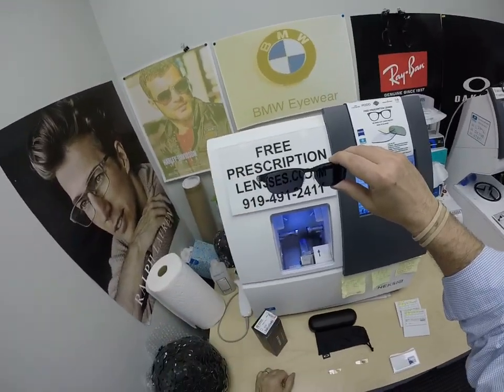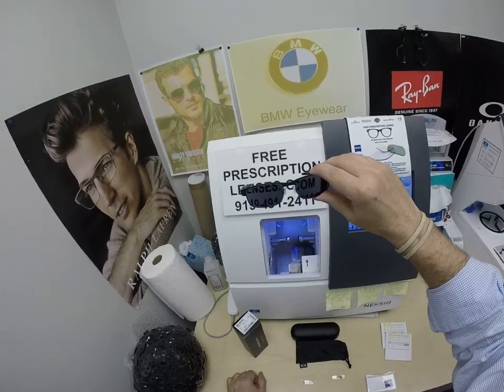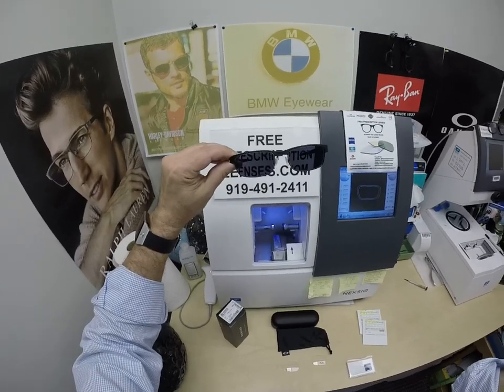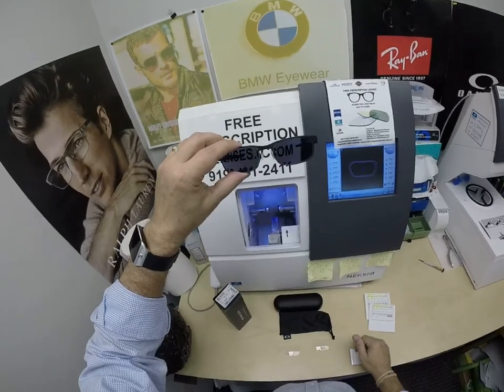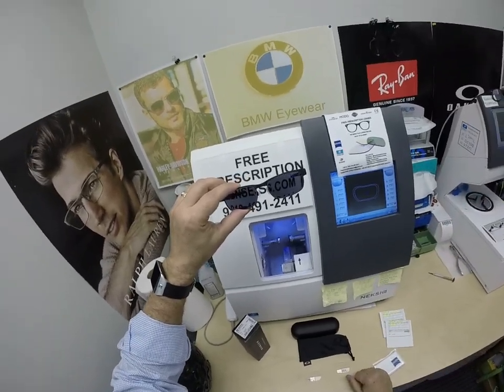I remind everyone: when it's a hundred degrees outside, you're miserable, they're miserable. Nobody and nothing works a hundred percent when it's a hundred degrees outside — we all work much better when it cools off. These Zeiss Photofusion Extra Gray are designed for extra active people who spend extra amounts of time outside and will get darker in hotter weather. So if you live in a hot climate or you just want the darkest lens possible, go with the Zeiss Photofusion Extra Gray.